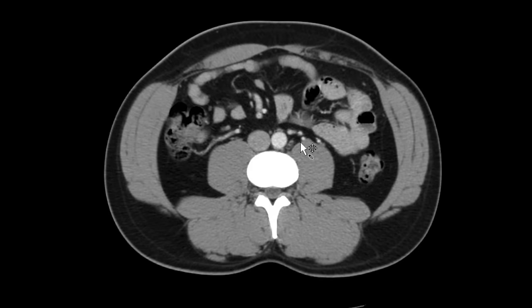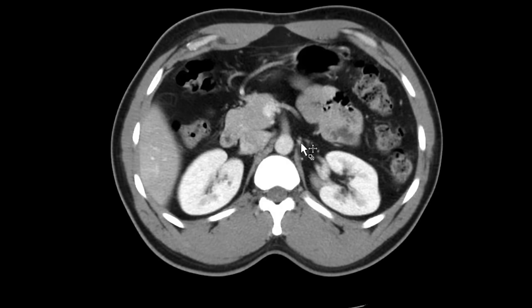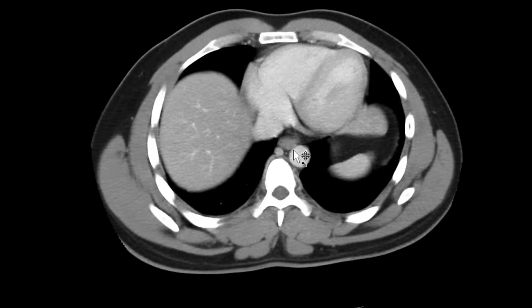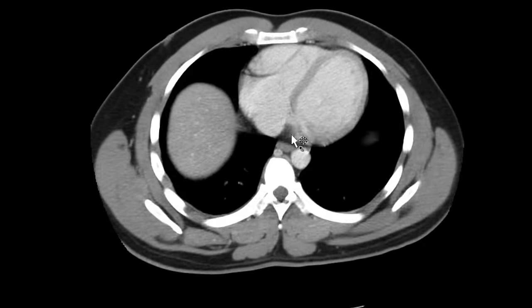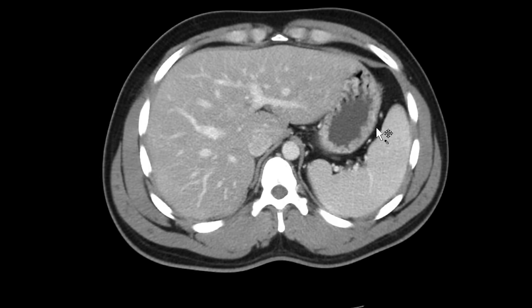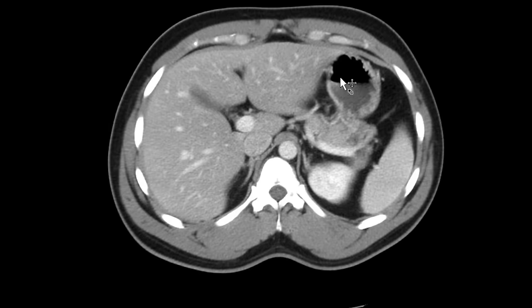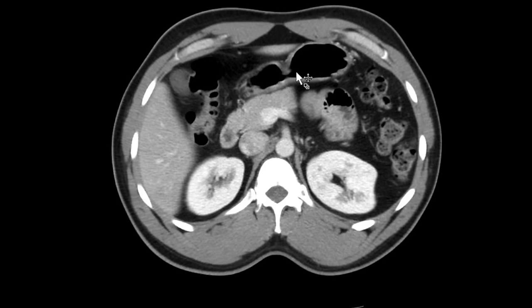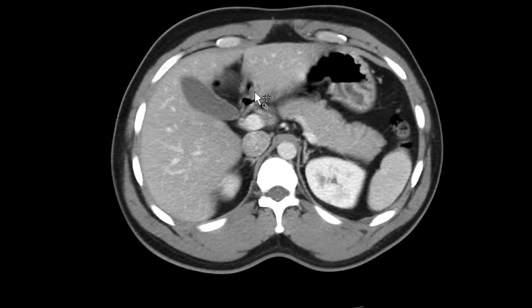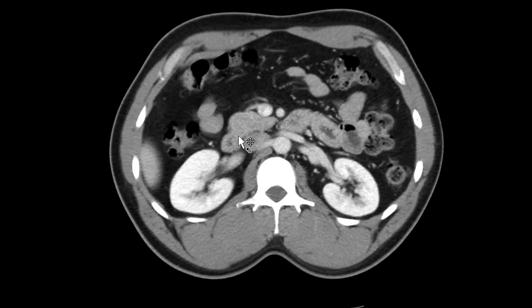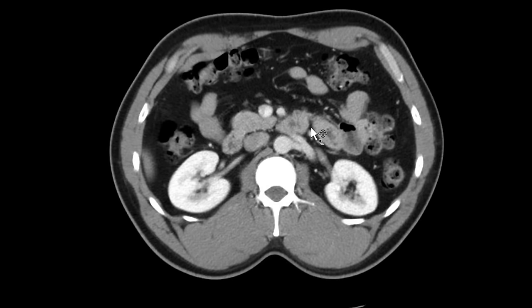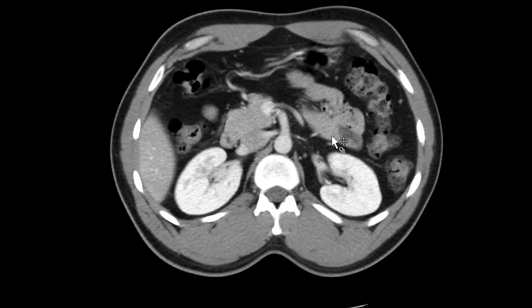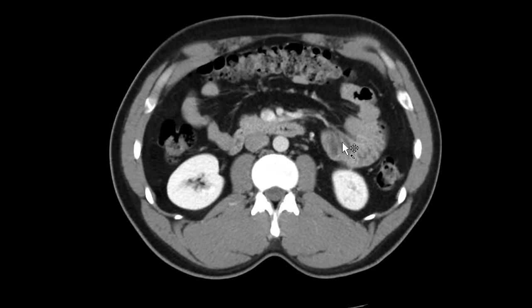Then I go all the way back up and start my search pattern. The first thing I do is follow the GE junction — the distal esophagus — down through the GE junction, through the stomach, followed around to the duodenum, and I follow the duodenum across midline past the ligament of Treitz through the first portion of the jejunum.